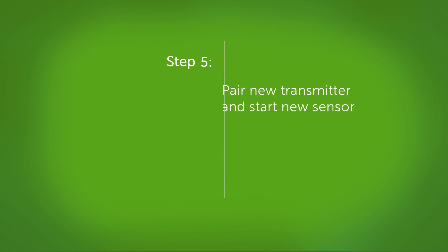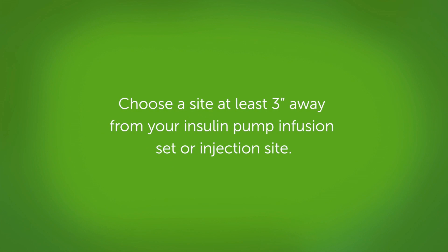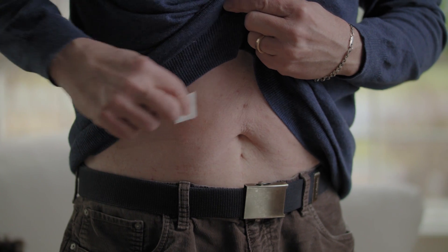Now you need to insert your sensor and attach your transmitter. Remember to insert the same sensor as the sensor code you just entered. First, wash and dry your hands. Choose a site to insert your sensor — at least three inches away from your insulin pump infusion set or injection site. Avoid bony areas like ribs and hip bones, and areas with scarring, tattoos, hair, or irritation. Also, you don't want to use the same sensor site two times in a row.